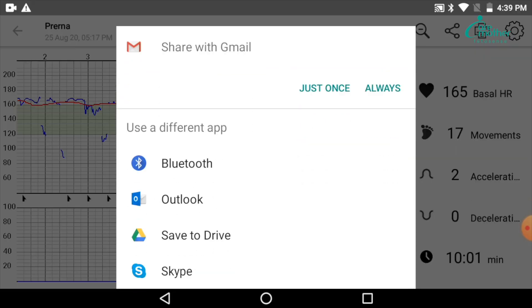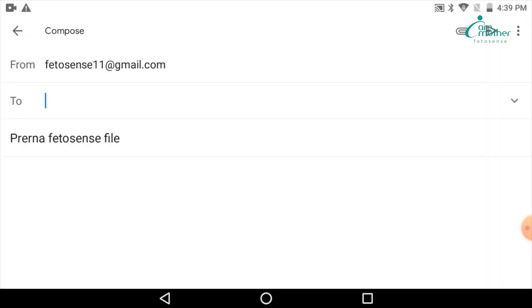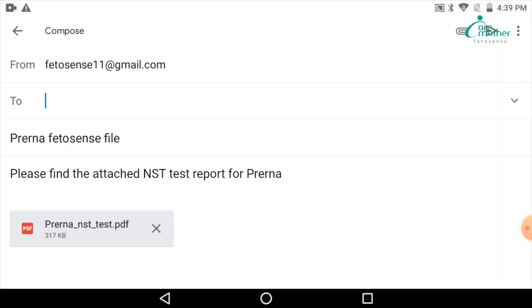For example, Gmail is one of the modes of sharing the data. There are others. You can also put in a SIM in this tab and use WhatsApp for data sharing. Say you are selecting Gmail.